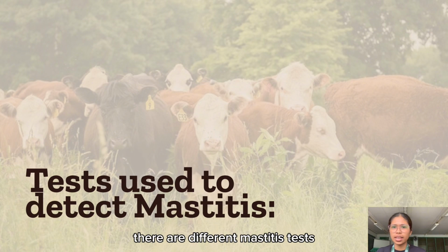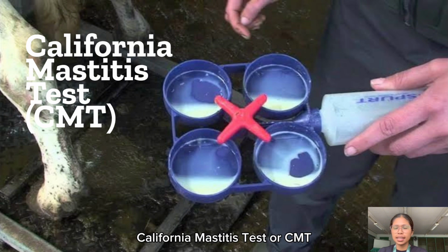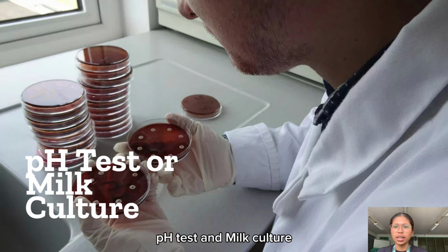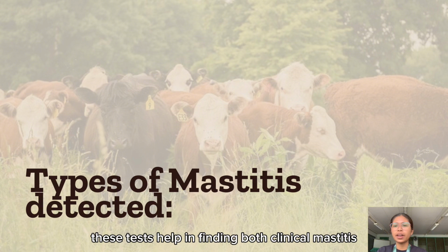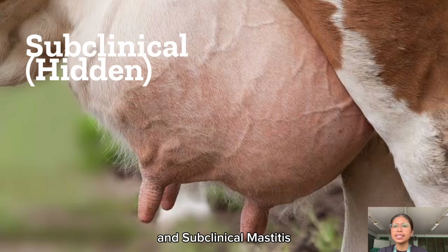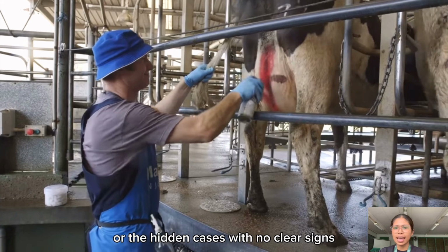There are different mastitis tests such as the California Mastitis Test or CMT, strip cup test, pH test, and milk culture. These tests help in finding both clinical mastitis, where there are changes in the milk that can be seen, and subclinical mastitis, or the hidden cases with no clear signs.